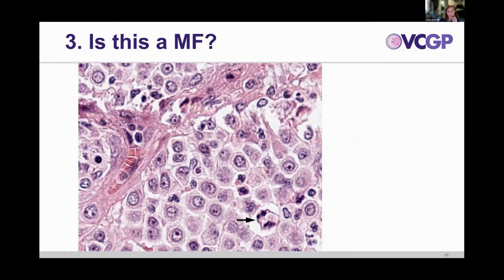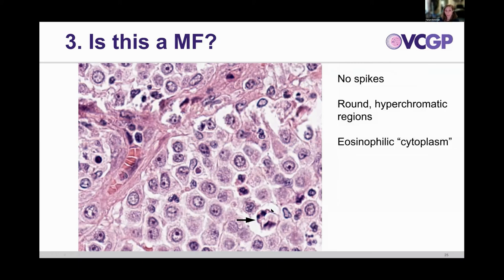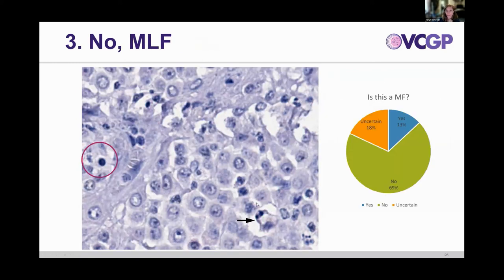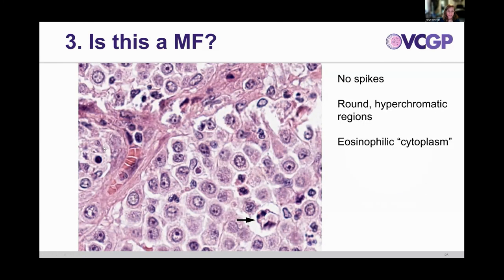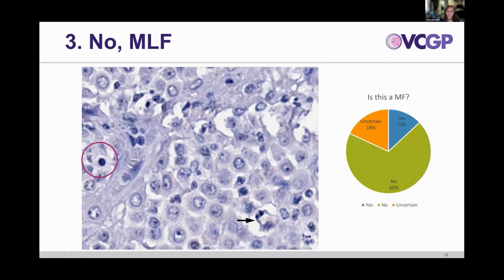Number three, at the bottom of the screen, is a structure with multiple small hyperchromatic areas, vacuolated, with somewhat eosinophilic cytoplasm compared to surrounding cells. It has multiple hyperchromatic structures with a pretty smooth outline. For this reason, this is not a mitotic figure — it is a mitotic-like figure, and it does not stain with PHH3. There was also another pyknotic nucleus in the image that also didn't stain. The vast majority of you agreed with that.